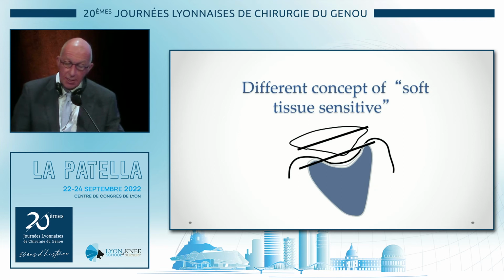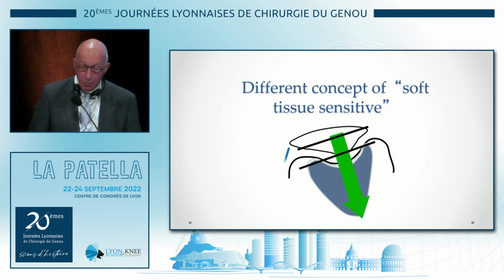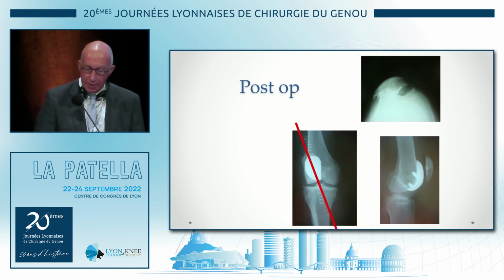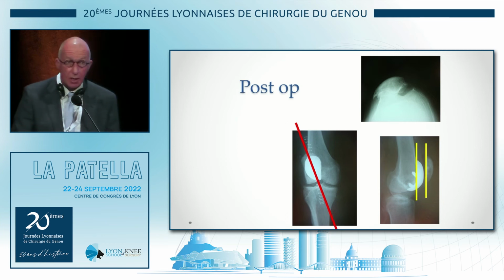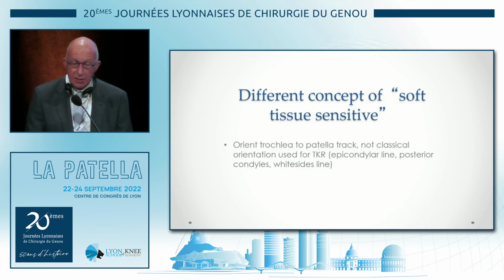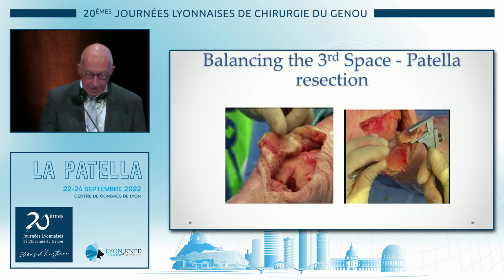So the soft tissue sensitive concept is orientating, as Seb said, along the lines of the existing trochlea, because then all the tensions in the soft tissue are the same, the patella tracks in the same way, and we don't have the issues of tightness and pain in the soft tissue. And so sometimes that gives you some weird post-operative x-rays, and you might think this is malaligned, but if you look at this true lateral, we can see that the patella and the trochlea are perfectly matched. So, orientate to the patella track, not the classical orientation of the total knee. This is not a total knee.